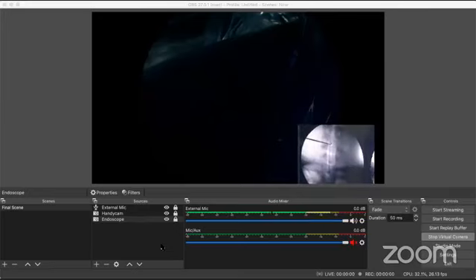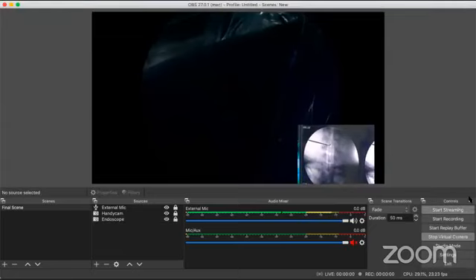Yes, now, sir, I don't want to do a central job. My job is not central. My osteophyte is in the foramen. So I need to come out onto the foramen. So I'm going to position myself here, coming a little out. And you can see, shoot please again. Yes, you can see the ball tip. The ball tip is exactly where the V stops and the facet joint starts. So this is exactly where I want to reach.